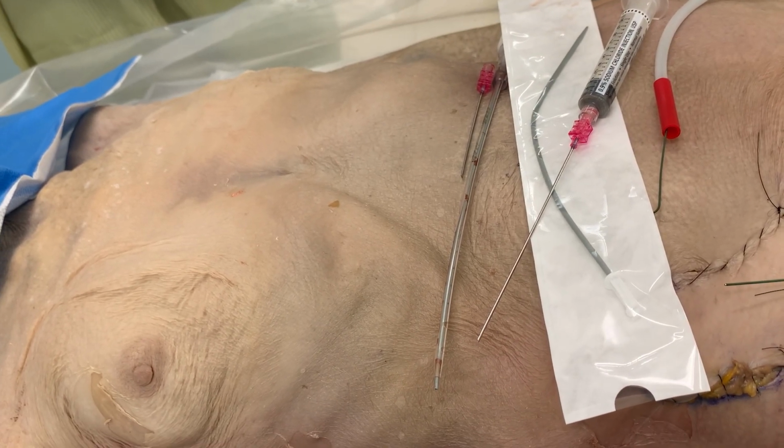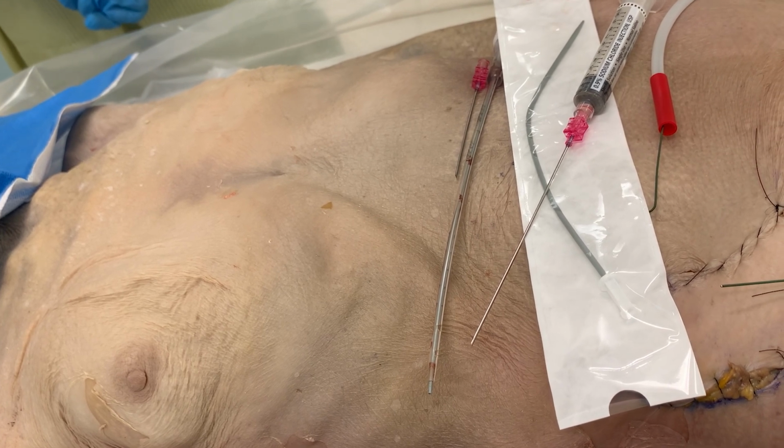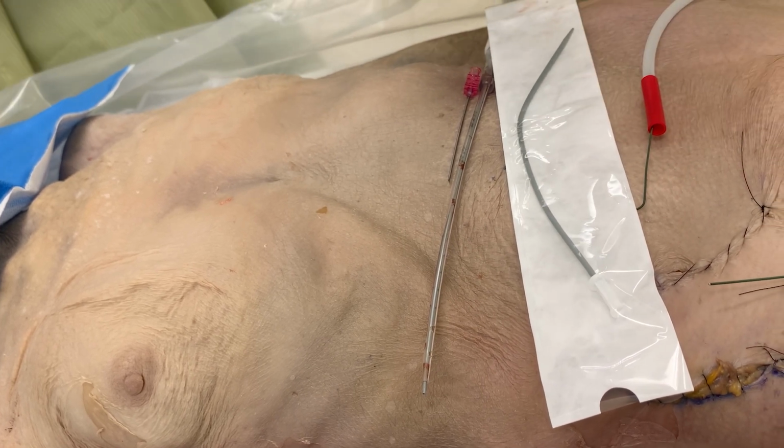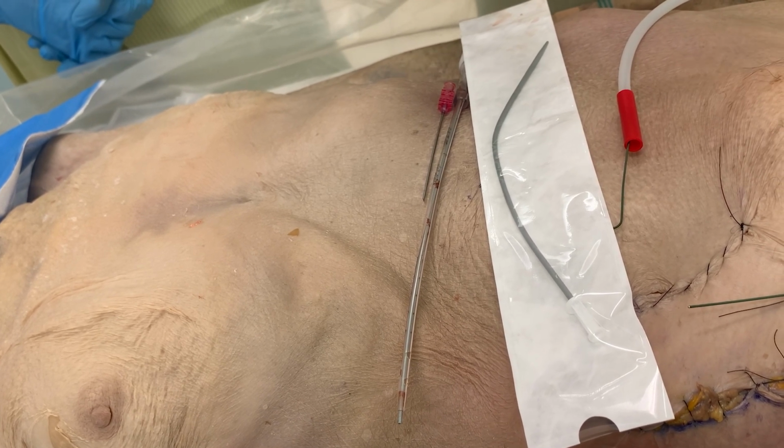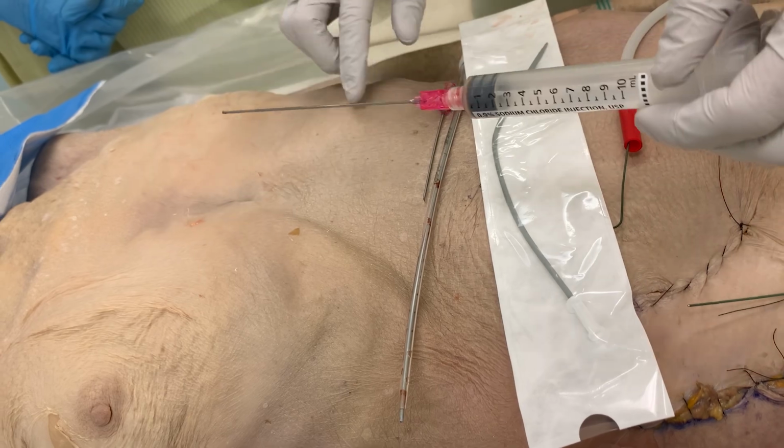Once the area is prepped, freeze the skin overlying the needle entry site with 1 to 2% lidocaine. Connect the syringe to the needle gently so that it can be easily removed without disrupting the needle position.